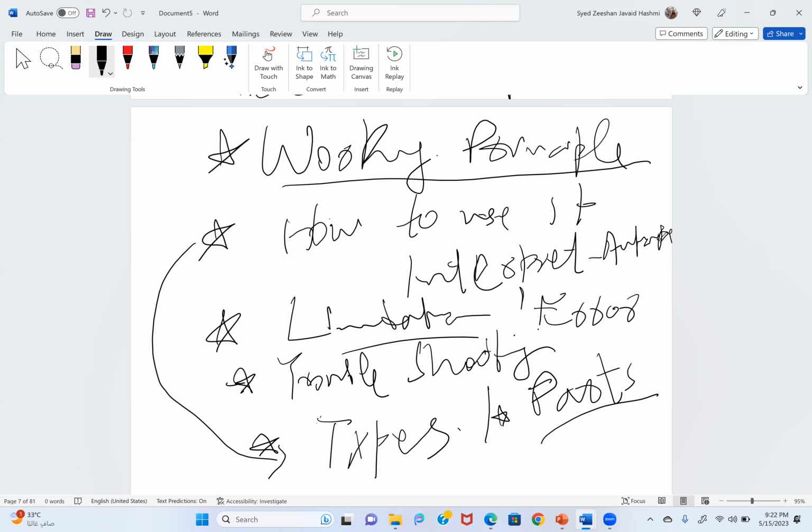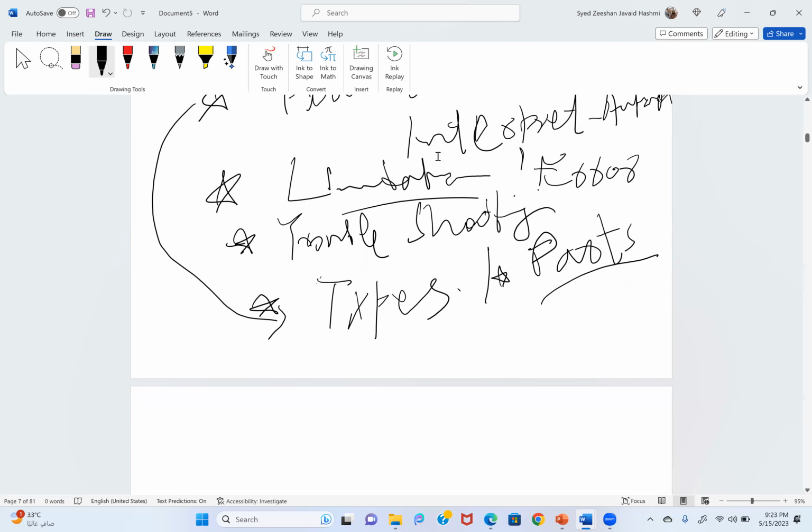Like if the pulse oximeter graph is not coming, it means a few things. Either the patient is cold, perfusion is not there, or the pulse oximeter is not placed nicely, or the probe is not good. Because if the waveform is not coming, whatever the reading is, whether it is 100% or 80%, it is not reliable. Okay. So this is how you will anticipate what you will do, what you will react. This is the basic thing you should be knowing about monitoring.